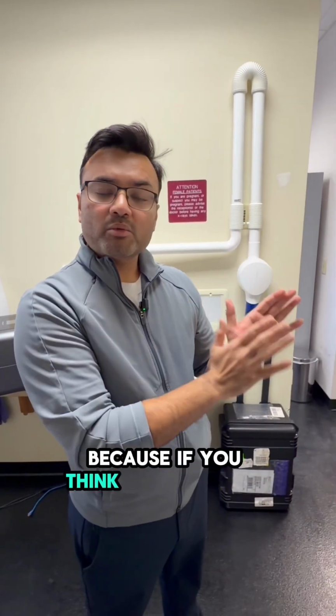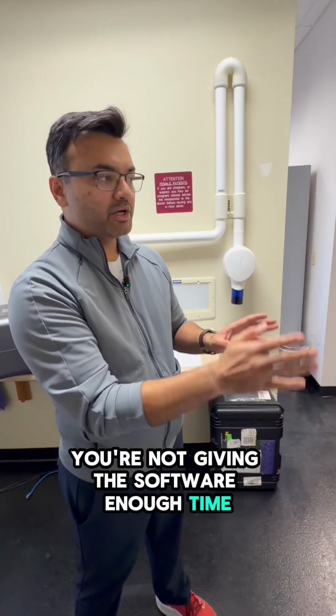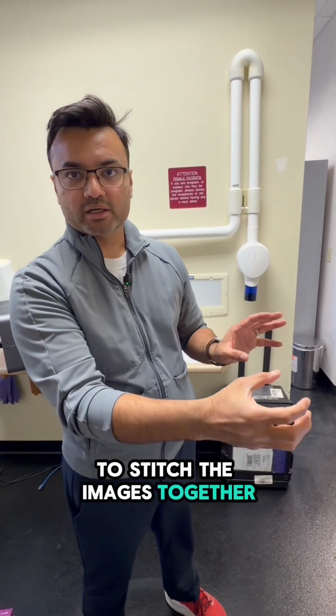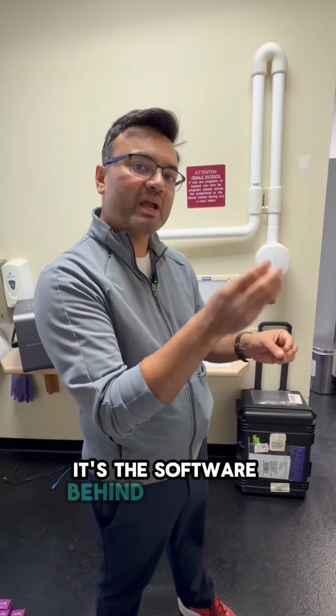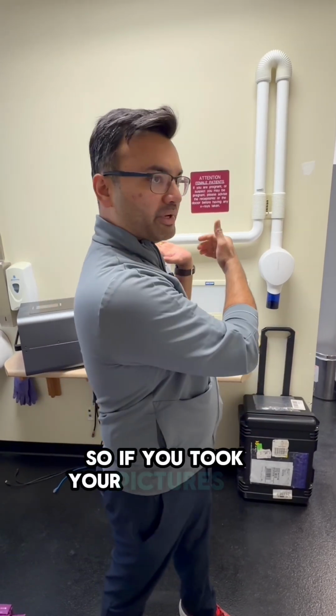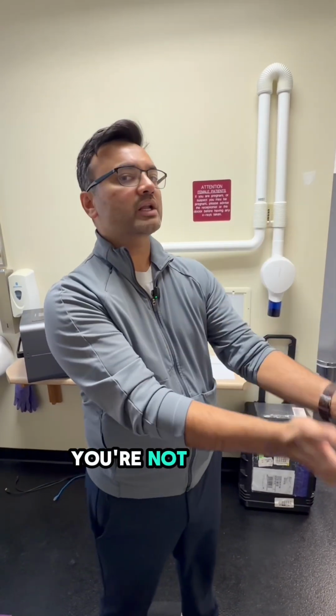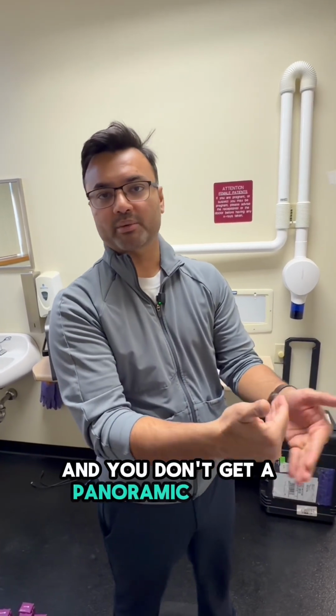Because if you think about what I just said, you're not giving the software enough time to stitch the images together. Again, the camera's job is only to take pictures. It's the software behind the camera that is really attaching the images together. So if you took your pictures too fast, you're not giving the software enough time to stitch the images together, and you don't get a panoramic picture.